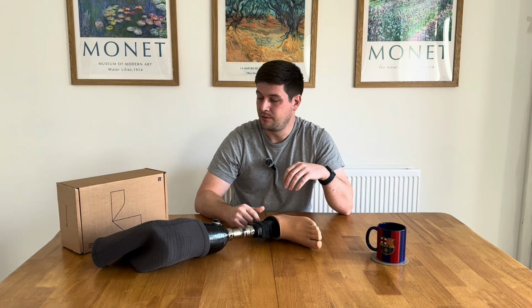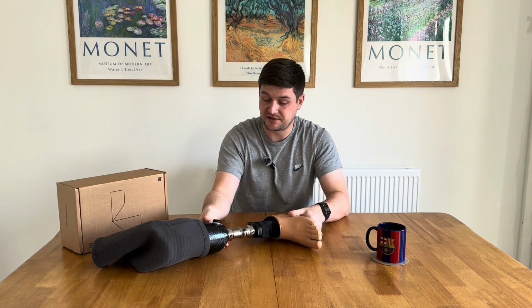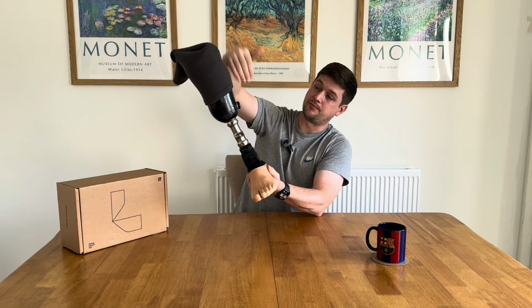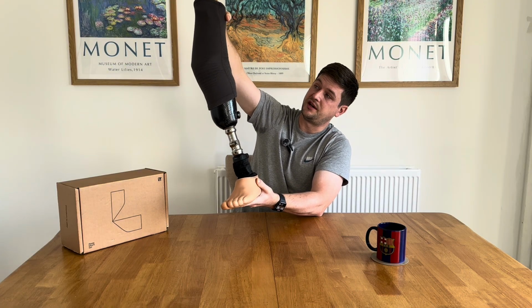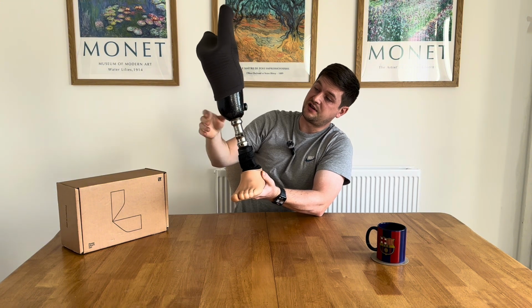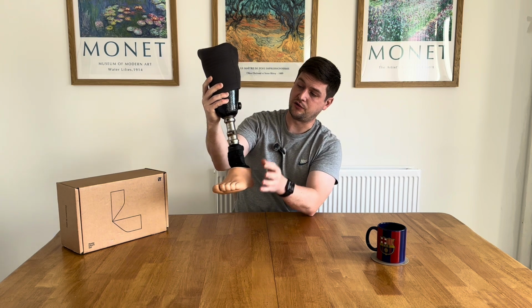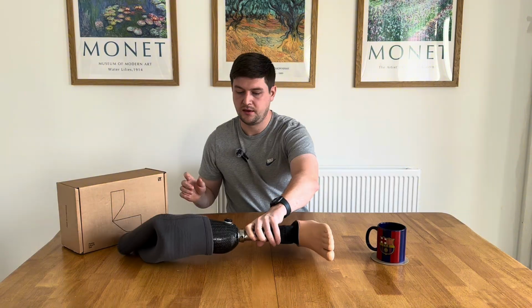But before I set this running blade up, I actually have to take apart this, my current leg, my everyday walking leg. This is the socket, the part that I put my stump in and that I wear. This silicone liner rolls over the top of my knee so they can secure to my leg. But I'm going to reuse this socket, and I've got to separate the shin, ankle and foot away from it. So we'll jump into that and do that now.